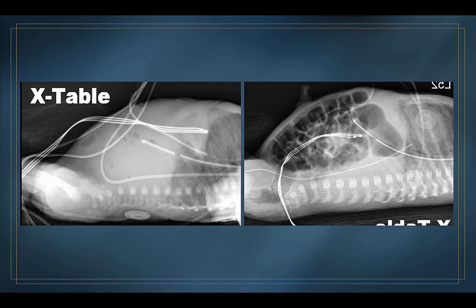Just to be 100% sure, it's not a bad idea to try and put the baby in a slight reverse Trendelenburg position. In other words, just build them up slightly so you're sure that their chest is slightly higher than their abdomen. These later babies are lying totally flat, and even totally flat, that's probably good enough.